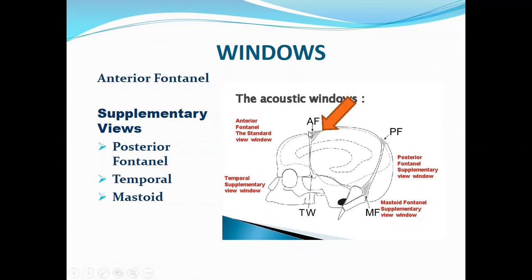And my Zambian brothers and sisters would agree about this anterior fontanelle. We used to say that babies breathe from here. They don't. They don't breathe from here. It's just that by the time they are born, it doesn't completely fuse. And as sonographers, it becomes a very, very important structure to use.